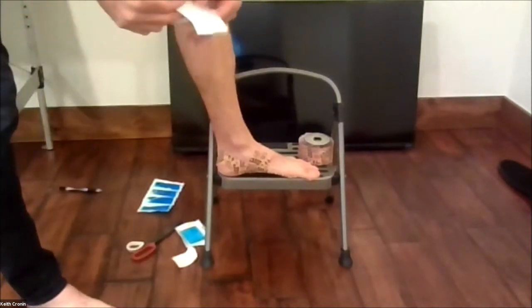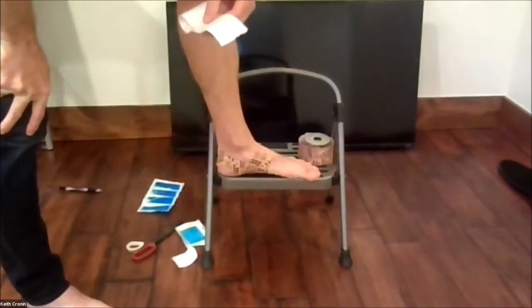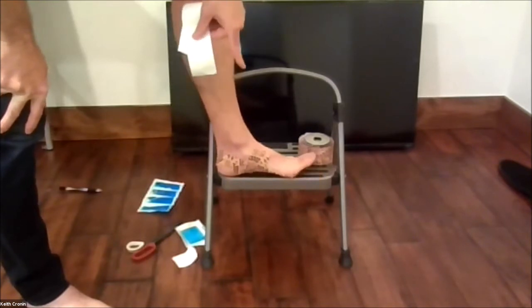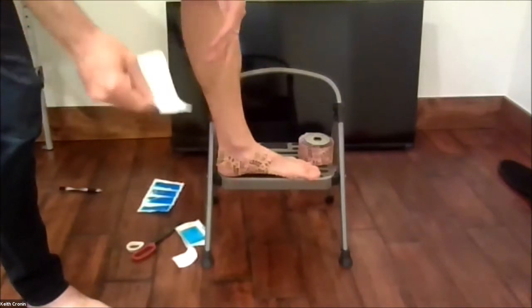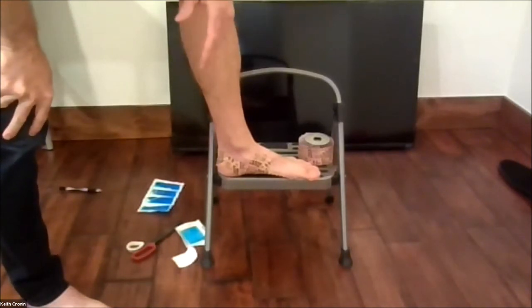And the really cool part about that is now the tape is going to take 5, 6, maybe kilograms of force. It may be a little bit lower depending on how much tension you put on it. But with high speed, it recoils faster. So the more speed you put through it, the more force you actually unload, which is why this works great with high performance athletes, but it works with your daily weekend warriors as well.